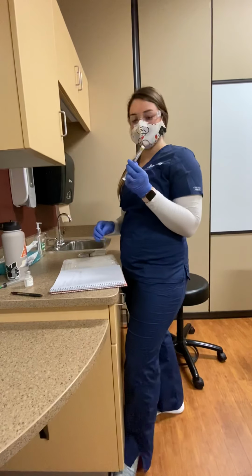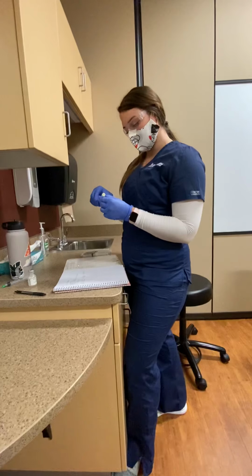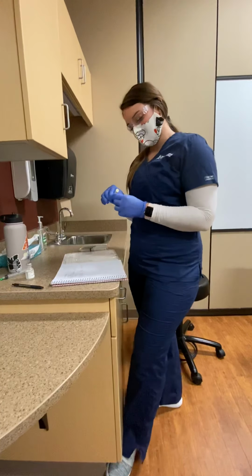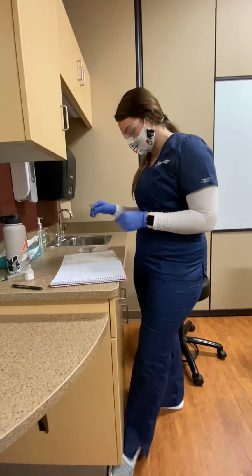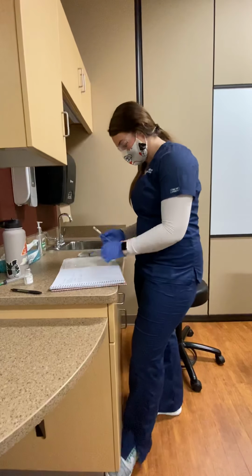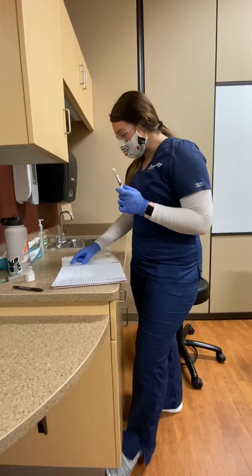And then I have a pre-filled syringe of Zofran, which is 5 milligrams every 2 milliliters. And the expiration date is 12/20/30, so it's not expired. All right, so I did my calculations and I got 1.6 milliliters. And her allergies are morphine. So this is Zofran, so that shouldn't be a problem.